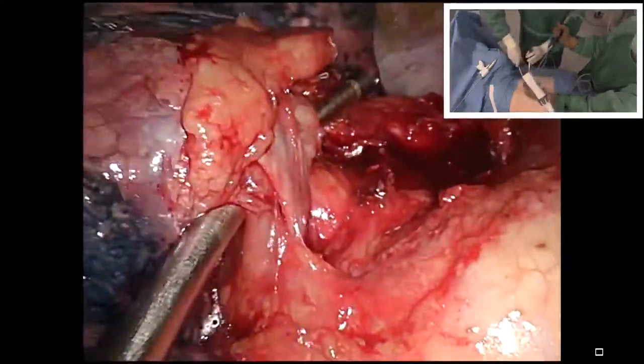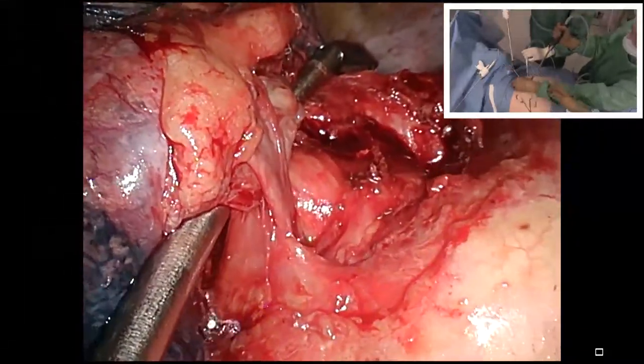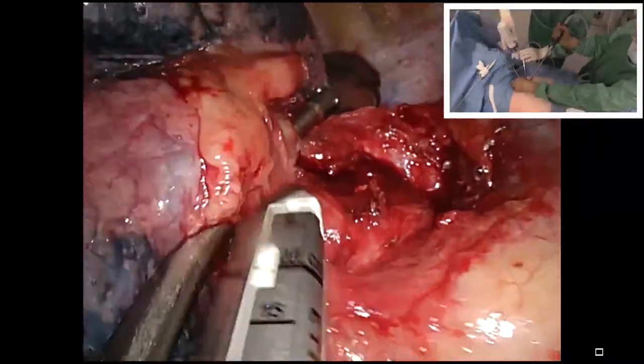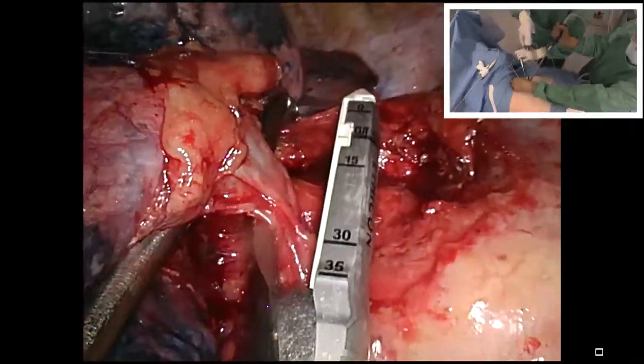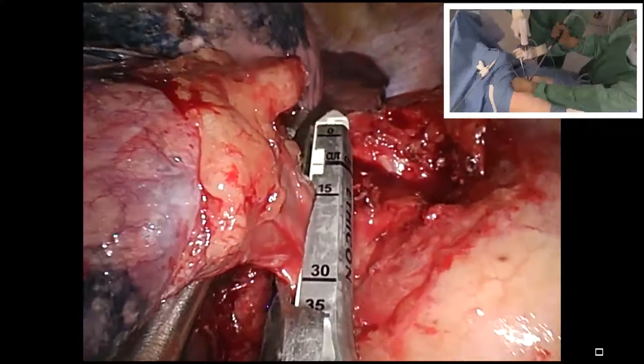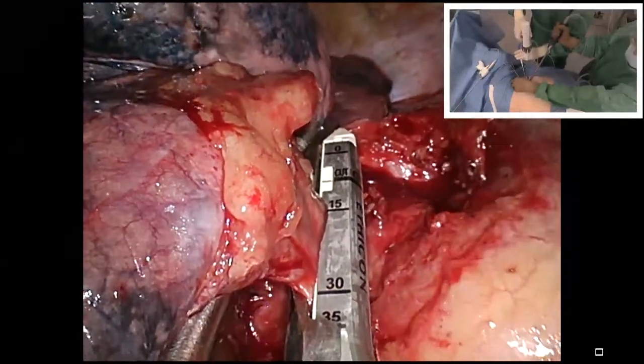Yeah. And then we have the artery protected behind with this sucker. You can see. This is the trick of the sucker. It's really good. So easy. You can see, one step and the other. Especially for the vein, yes, always.